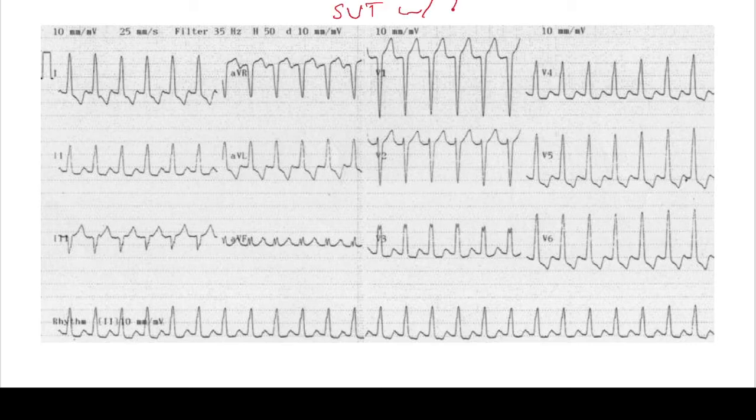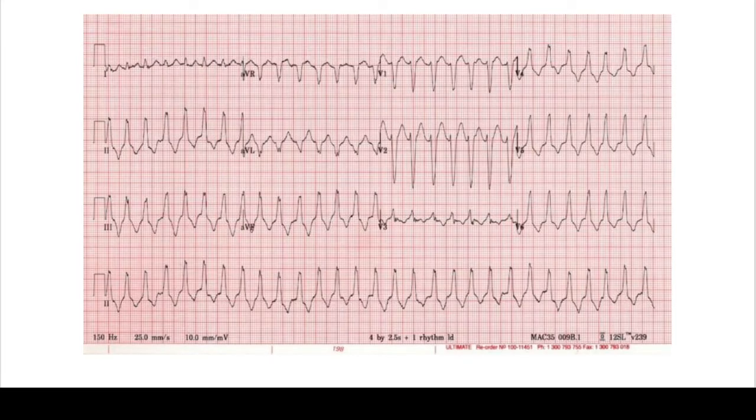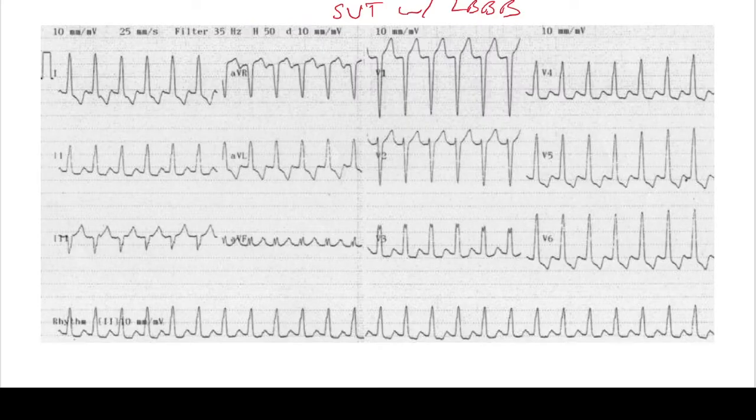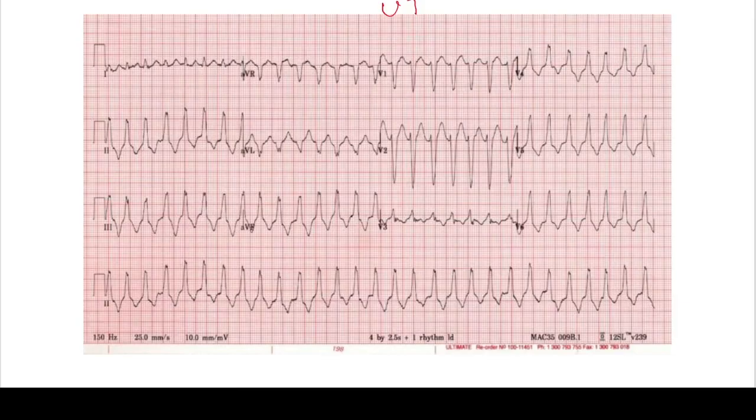However, I want you to compare it to this EKG, which is very similar. You see that it's also beating pretty quickly, almost more than 150 beats per minute. It's also wide complex, it's also regular. But this was actually a VT. So the main thing to note here is that SVT with aberrancy and VT look almost identical.